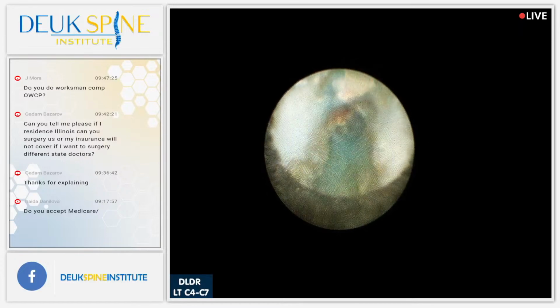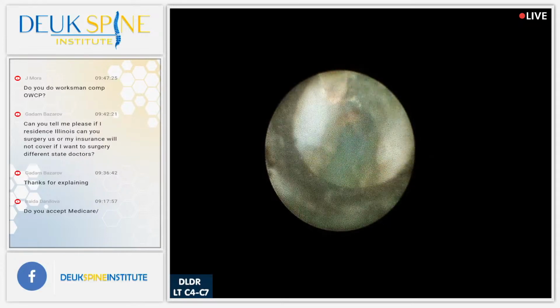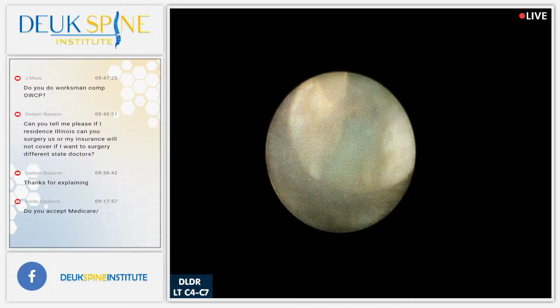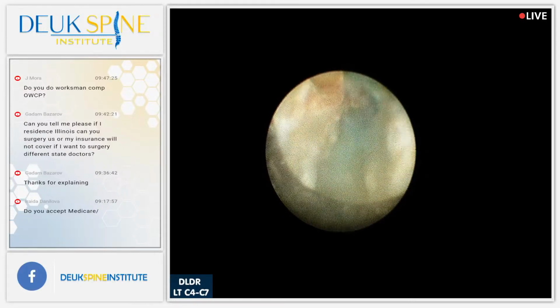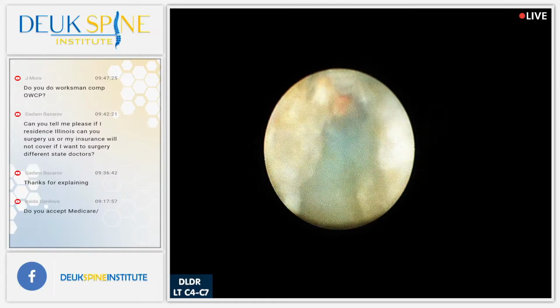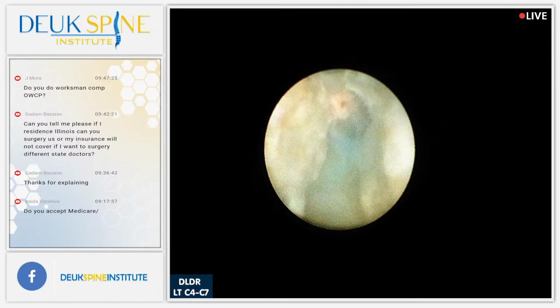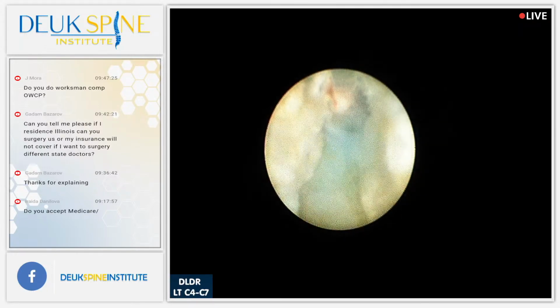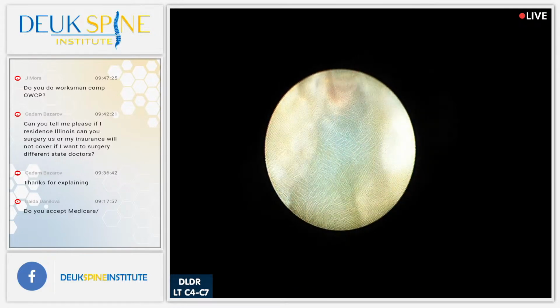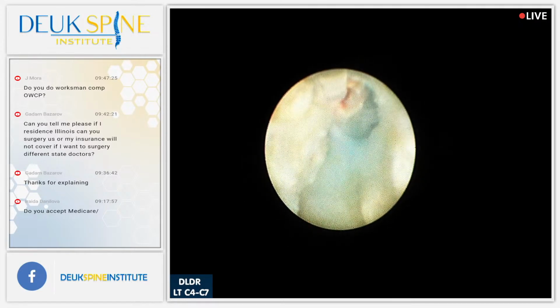So people ask me, Dr. Duke, can you take bone spurs out with laser? Absolutely. It's the best way to take bone spurs, the safest way. Folks, that laser fiber is 0.5 millimeter, so imagine how precise I am being right now. If the whole width of the fiber is 0.5 millimeter, I'm taking out less than that. I'm taking out about 1/10 of a millimeter at a time.